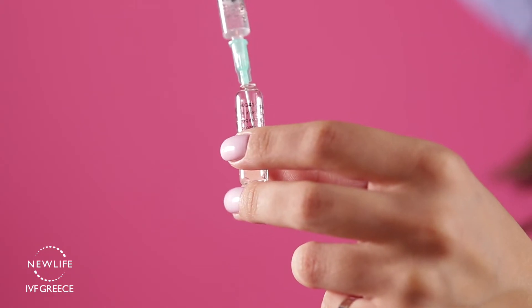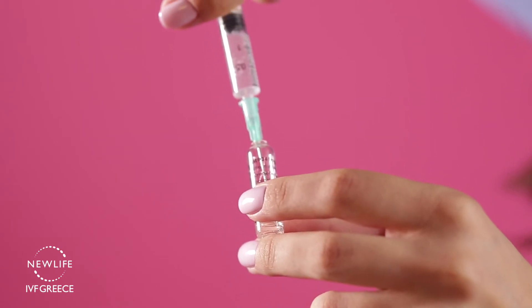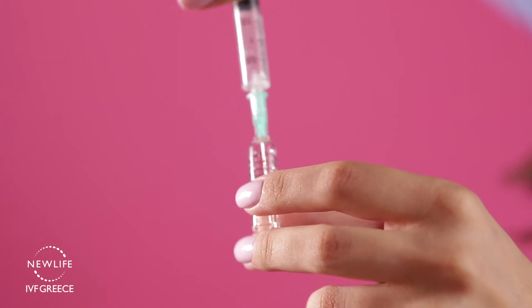Insert the needle into the ampule and extract all the contents by pulling back the plunger. Hold the syringe with the needle pointing upwards and tap gently to remove unwanted air. Press the plunger slowly until you see a small drop of liquid forming at the top of the needle.